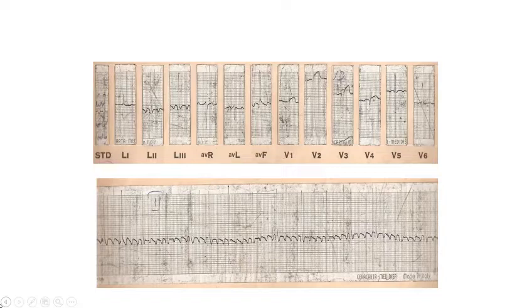How do you differentiate between atrial flutter and atrial tachycardia? Sometimes atrial tachycardia can have a rate of around 260, 280, and sometimes flutter also can have a rate of around 260, 280. So when they overlap, what will be the point for you to make a diagnosis that this is a flutter and not a tachycardia? Flutter waves, the varying undulations, sir. They undulate around the isoelectric line. Yeah, in flutter there is no isoelectric line.